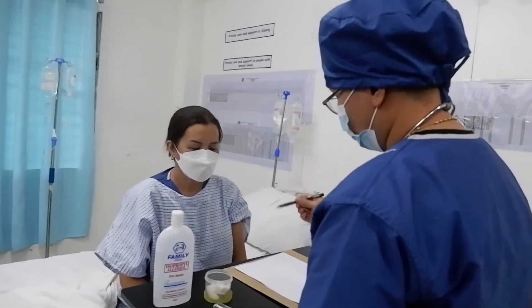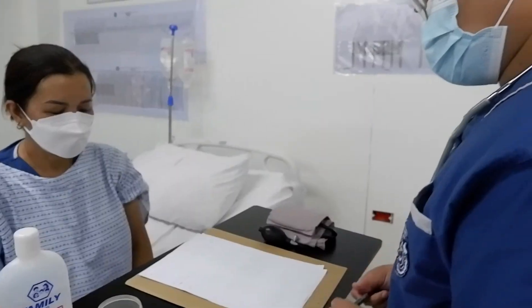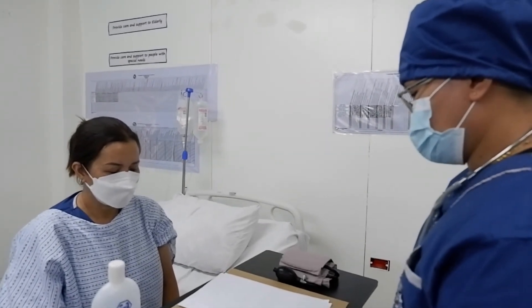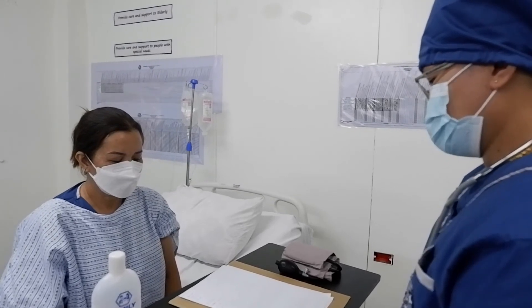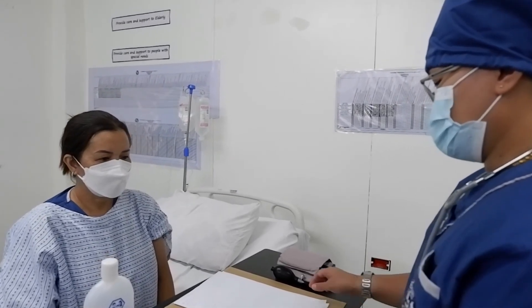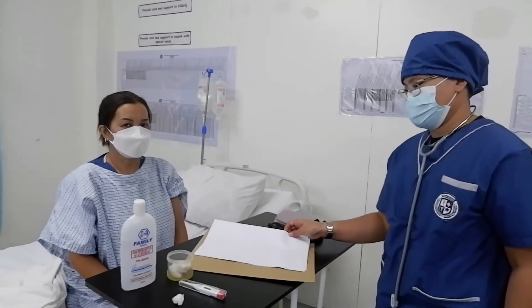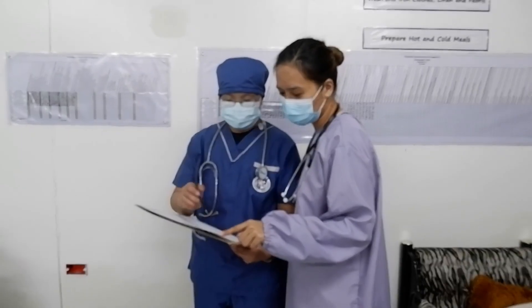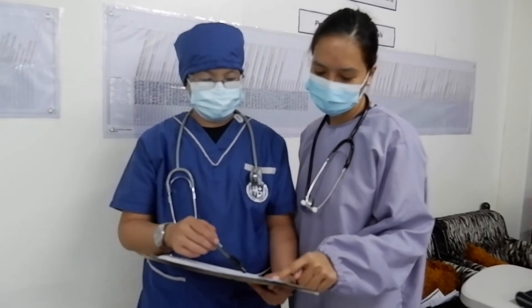After getting all vital signs, tell the patient the results. Miss Rose, your temperature is 35.9, your pulse rate is 74, your respiratory rate is 21, and your blood pressure is 110 over 80 — all of these are normal. The caregiver then reports all results to the doctor.